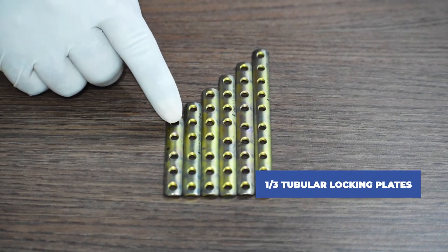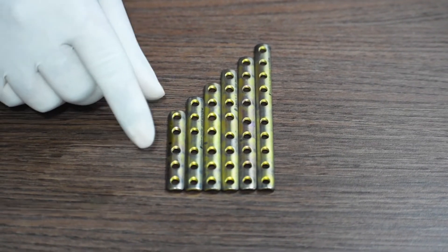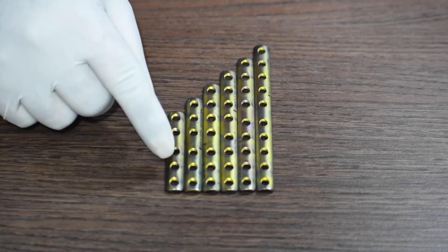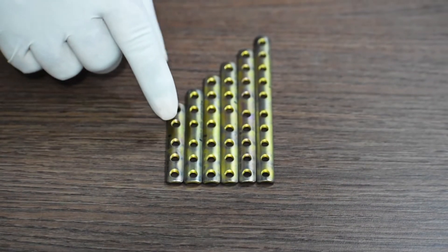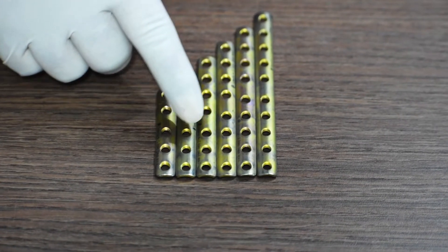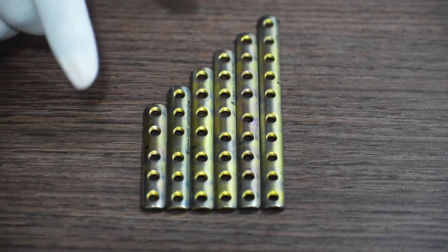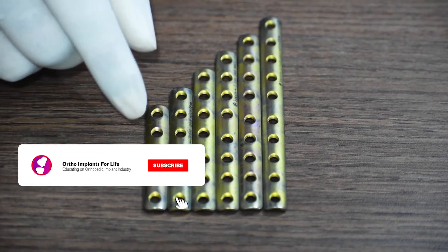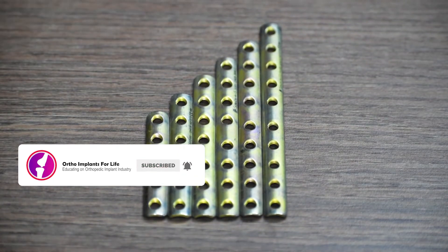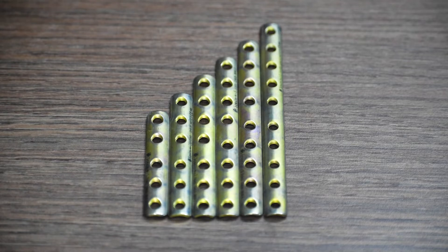This is the one-third tubular locking plate. It comes in a round hole and is similarly available from five hole to ten hole with one hole gap between each plate: five holes, six holes, seven holes, eight holes, nine holes, and ten holes. This is given in one bunch only and does not come in two sets. Round hole means you can only fix a locking screw, unlike combi holes where you have both the options of a locking or a cortical screw.